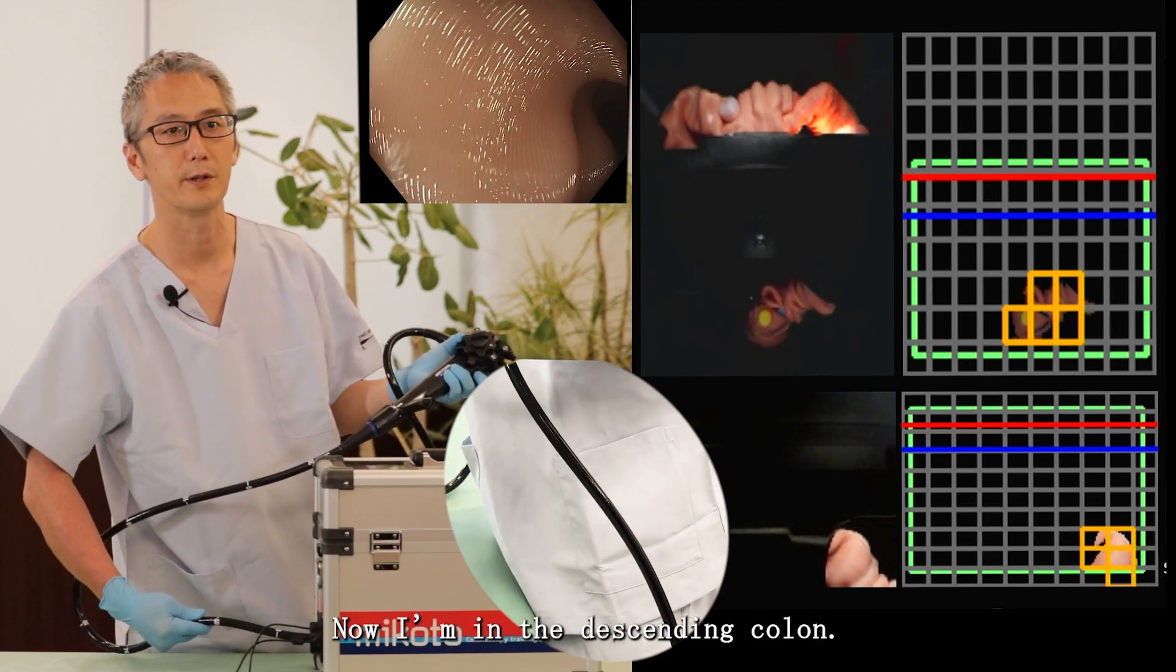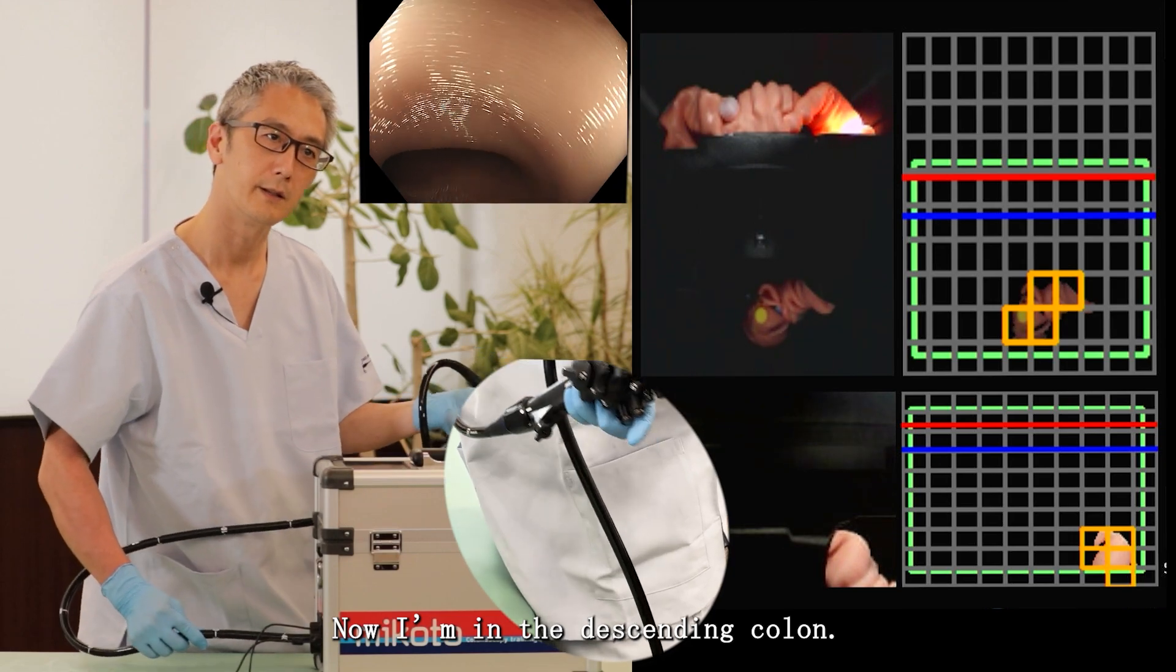Now the sigmoid colon is straight and now I'm in the descending colon.